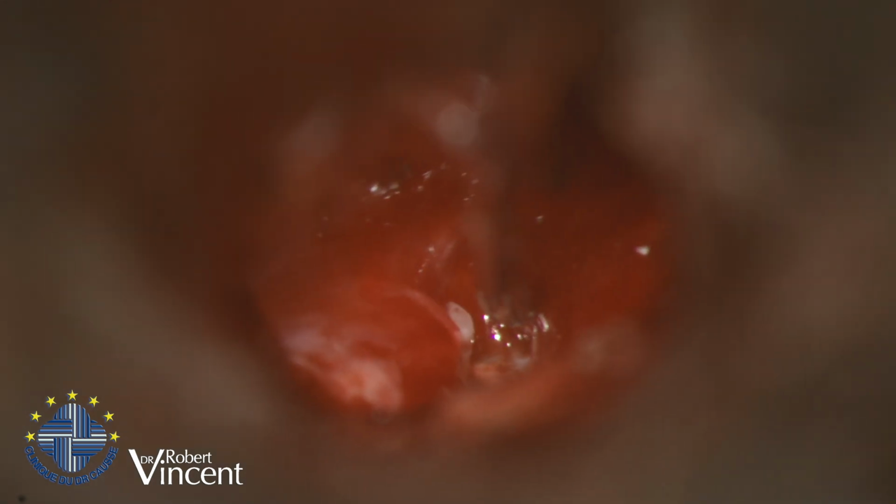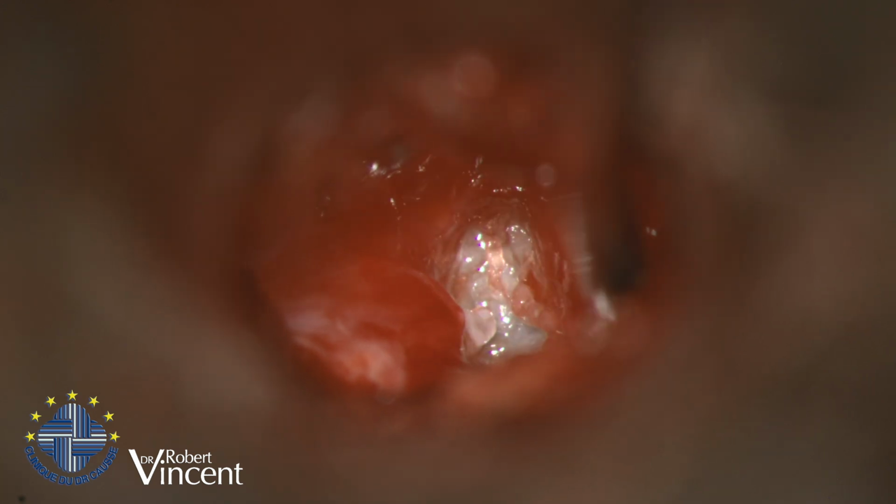Here is the footplate. I need to know if it's fixed or not. Okay, I'll check it now. I'm going to check it now, and it's fixed. Yeah, it's a fixed footplate. So it will be a second stage then.